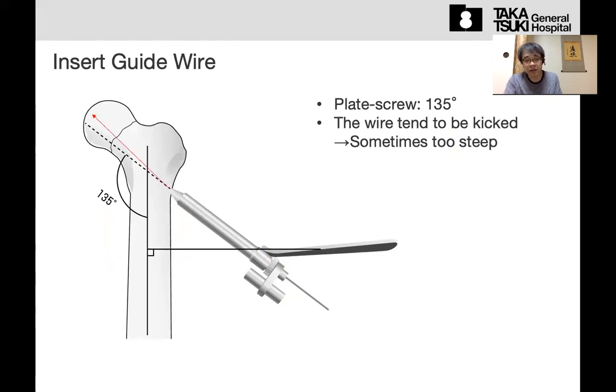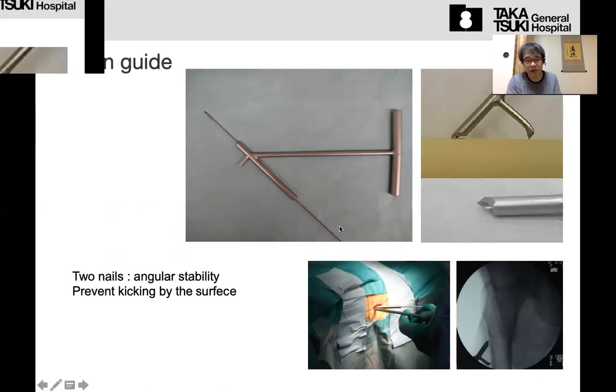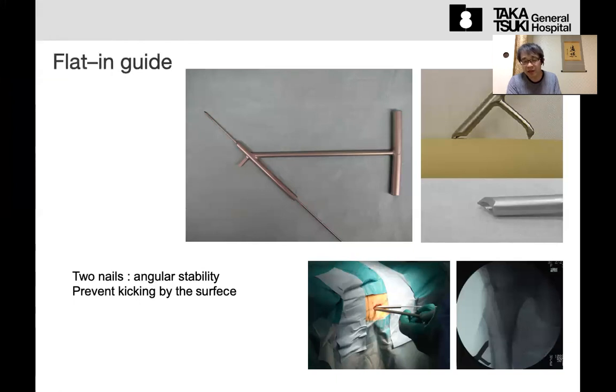To prevent this, I devised this type of guide. This guide has two nails to put on the lateral cortex of the femur. Then push both nails on the lateral cortex, so this angle is fixed at 135. In addition, to prevent the kick on the lateral surface of the cortex, this contact point is above the pin insertion. That can prevent the bending or the kicking of the guide wire.